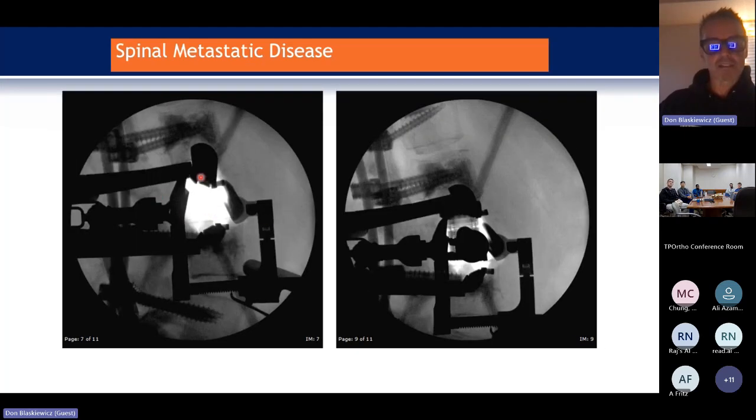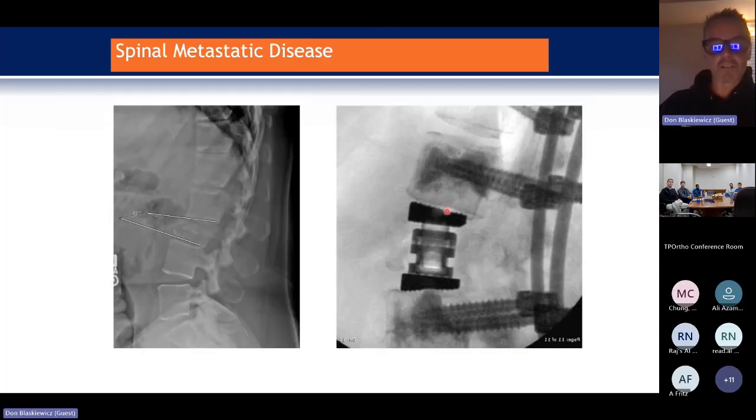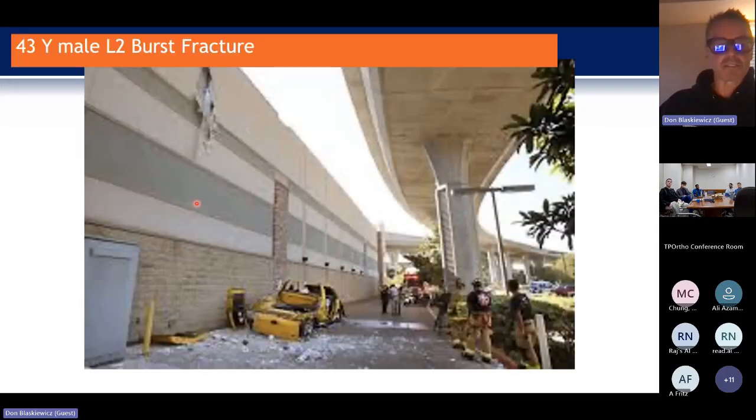I mean, gosh, that body looks non-existent. And then getting the implant in there, and again trying to make sure that we maintain our alignment objectives. She went from 12 degrees of kyphosis into a more normative alignment. Here collapsed and there expanded, and that Cobb angle corrected.